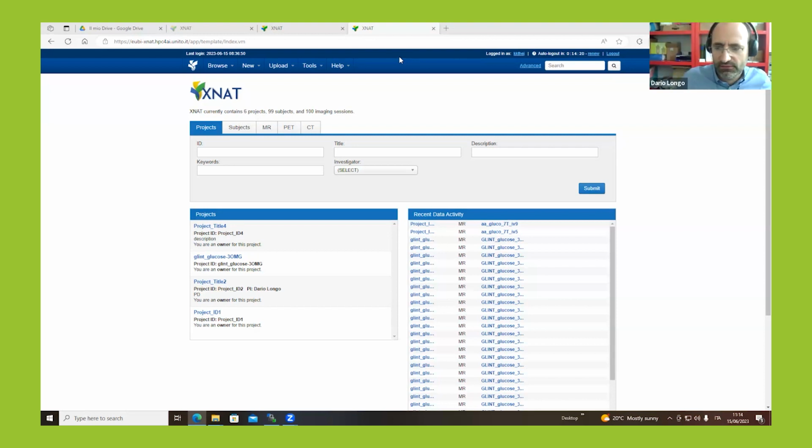Okay, so thanks, Kranthi. I just want to stress one important point from my perspective: once you have a platform where you can store and upload your images, the main advantage is that you don't need to download the images and share them.